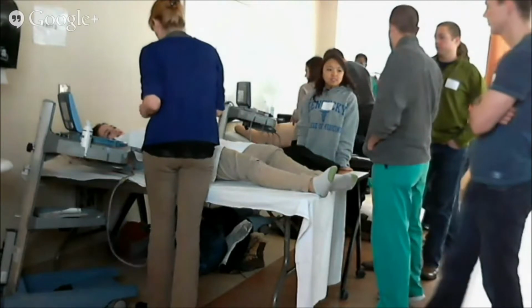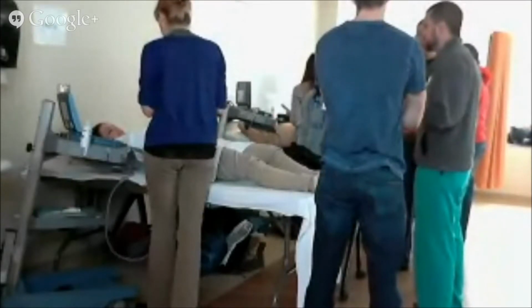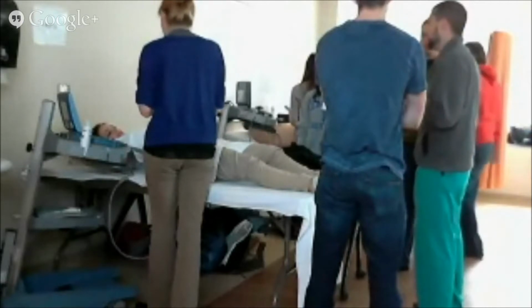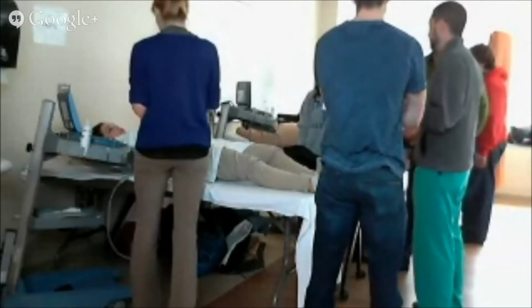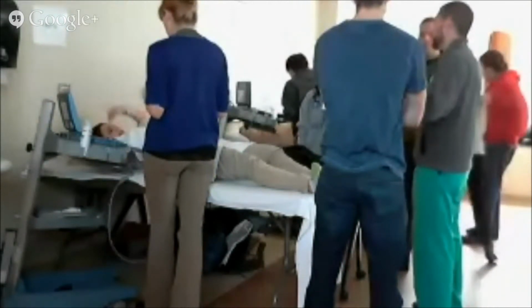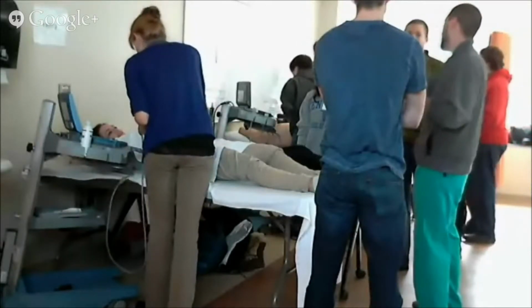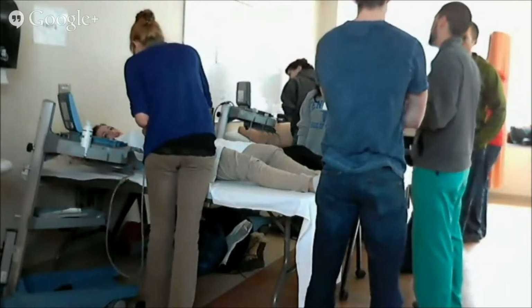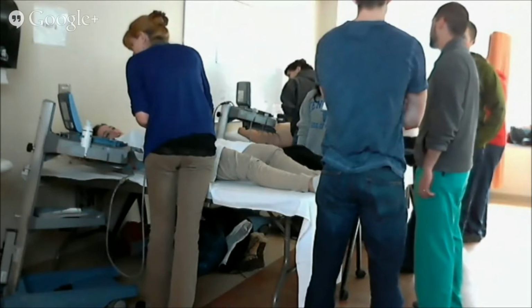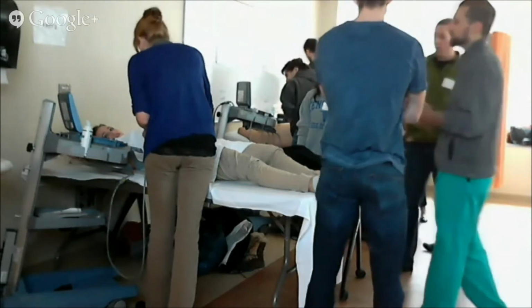There we go. So let's say you had someone with a big distended belly and abdominal trauma, tachycardic, and you do a FAST scan and it's negative. Why might that be? Another good way, let's say they had a hemoglobin right before they got in the car, they left the hospital, it was like 14, and now there's people that... Yes, so ultrasound takes time to show it.